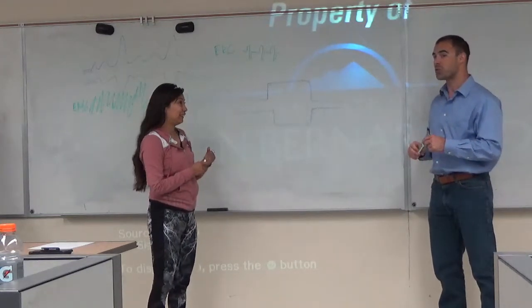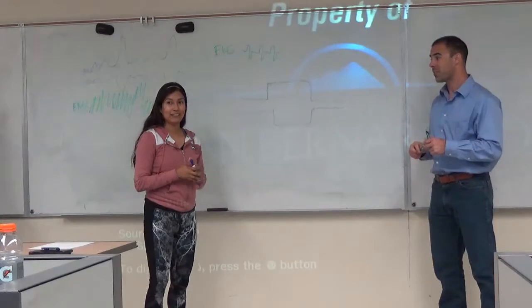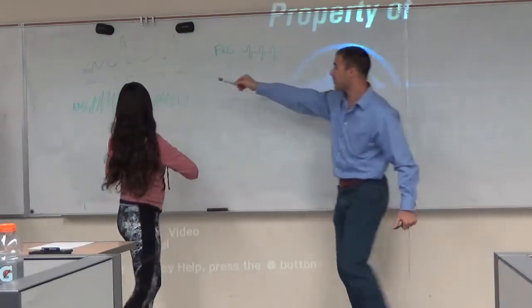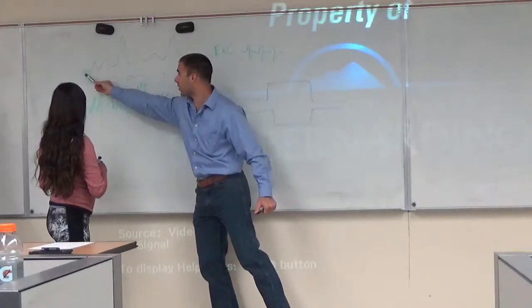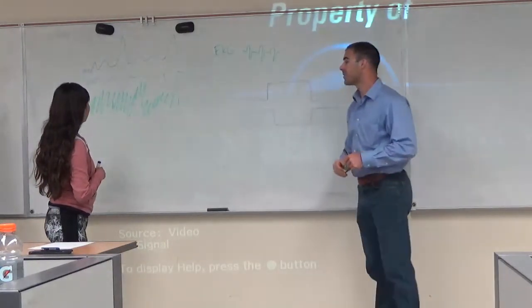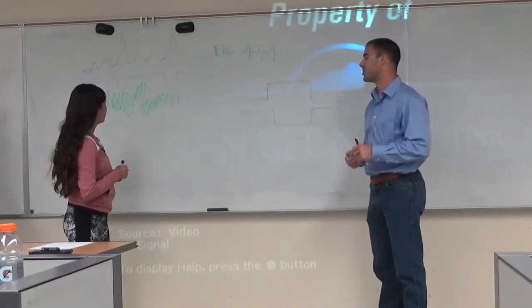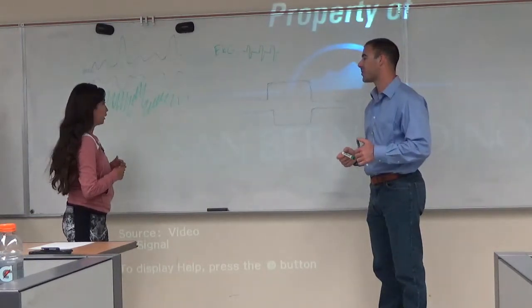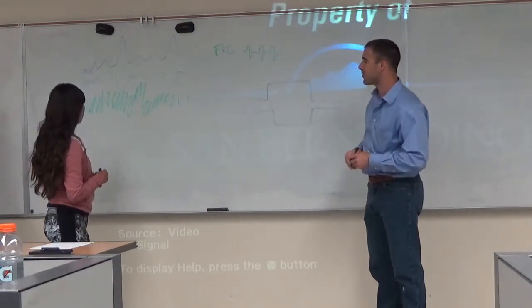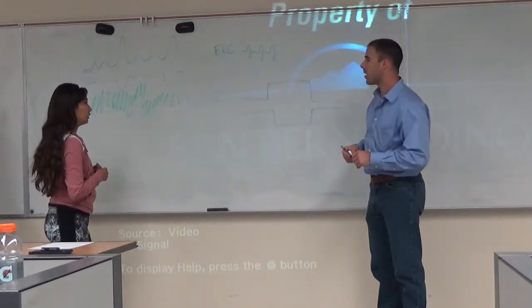So, do you remember what George and I were just talking about? Okay, so if we have these here, this is V, E, O, G. Remember what those stand for? So what does G stand for? Gram. Okay, so we'll work backwards. Let's talk about the O here. What do you think the O stands for? Ocular.